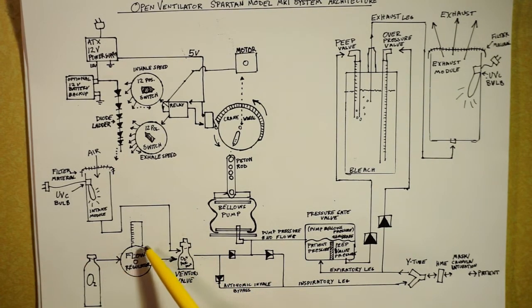Oxygen tank and flow regulator are commonly available parts. If you have oxygen, you probably have a flow regulator. This Venturi valve, there are a lot of open source and crowdsourced projects 3D printing these or injection molding these, and these are also available medically. We take this as a given in our project and have tried not to reduplicate the efforts of others. We plan to just use one of these from a different project.